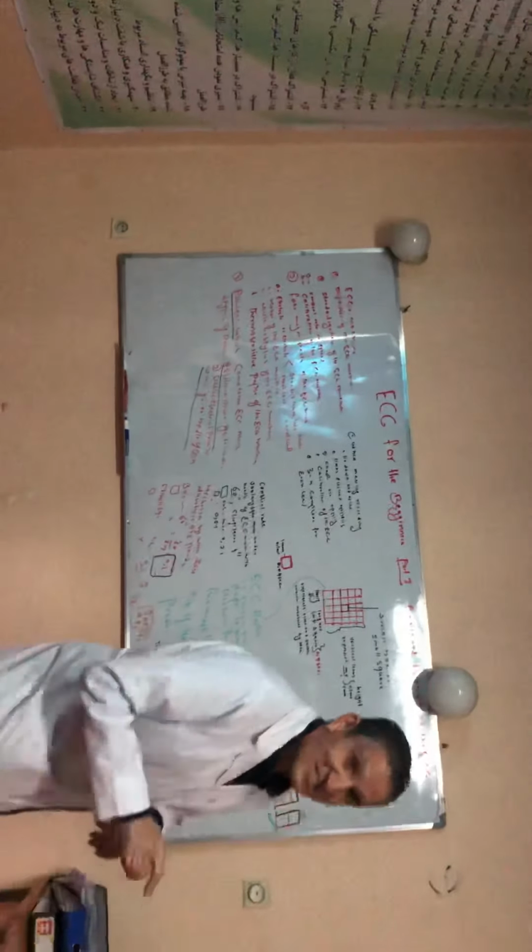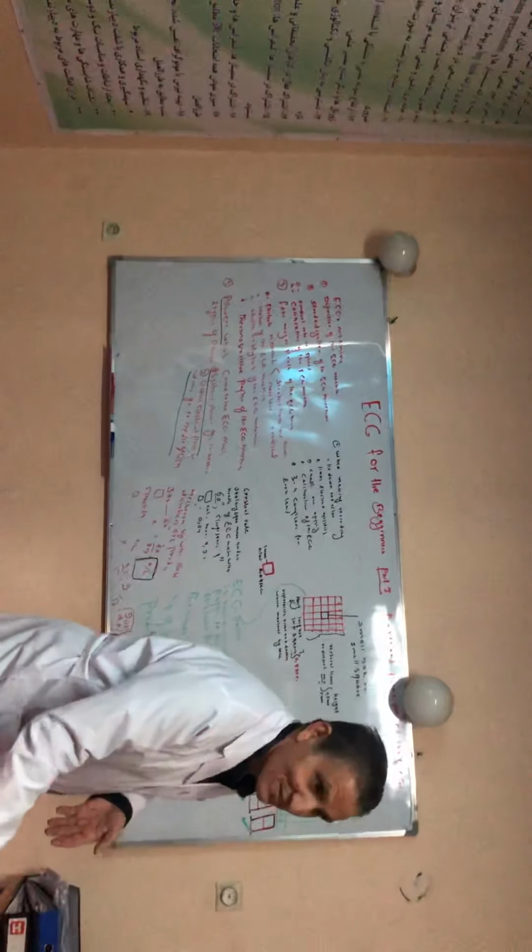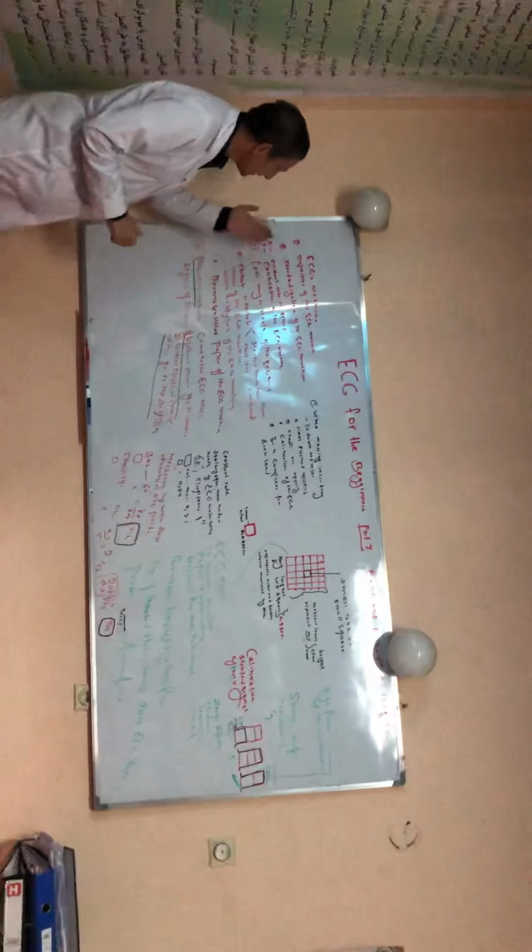This ECG machine is an electrocardiograph. And the third one was the ECG graph. ECG graph is defined as a series of waves and deflections which are seen during one cardiac cycle. Now I come back to this lecture, the ECG machine.